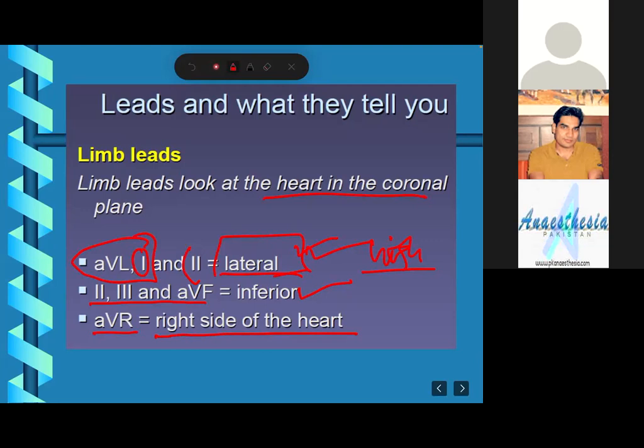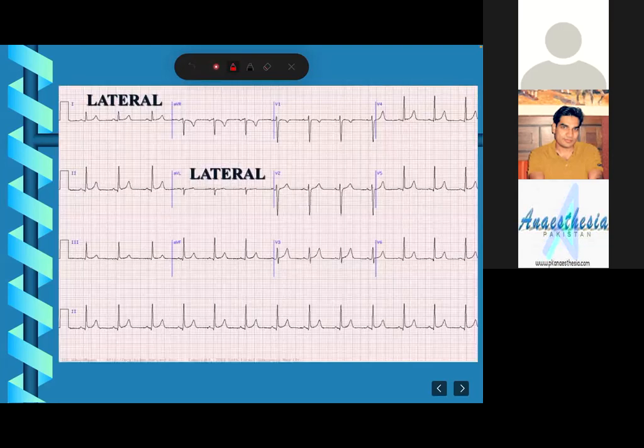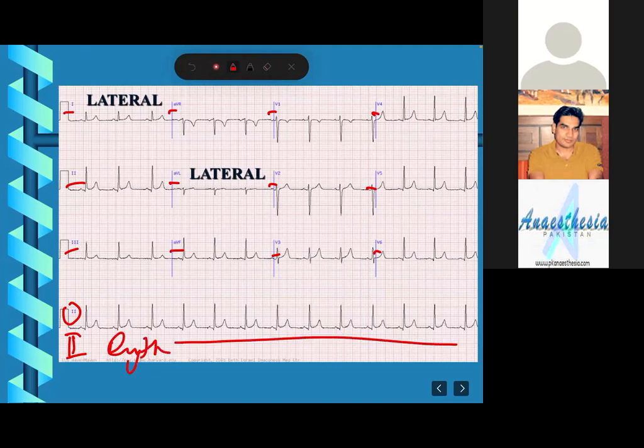If we see an ECG, there is always a pattern: 1, 2, 3, AVR, AVL, AVF, then V1, V2, V3, V4, V5, V6, and lead 2 as a continuous rhythm strip. This is the pattern of a standard 12 lead paper ECG.